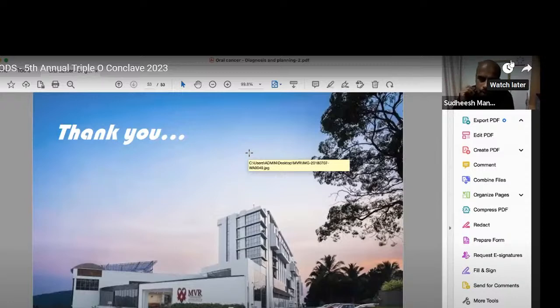We open the neck with a small incision and identify the node with this dye, since the color will be changed. We take that node alone and send it for frozen section histopathology examination to look for metastasis. If the node is negative, then you can keep the neck under observation. If the node is positive, then you proceed with neck dissection. That is the concept of sentinel node biopsy.